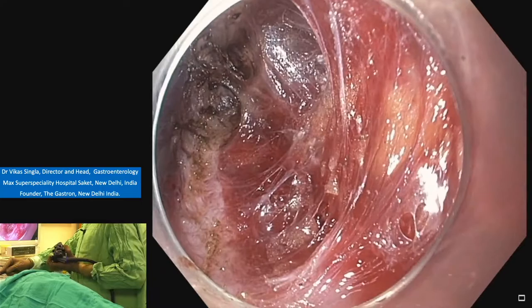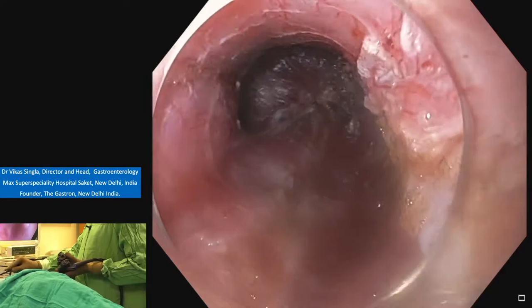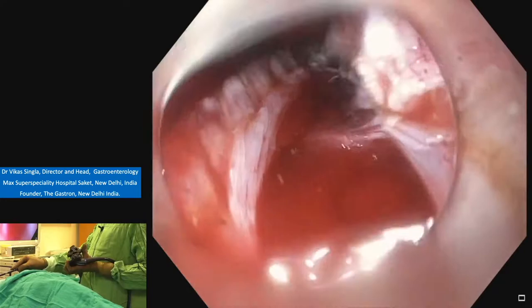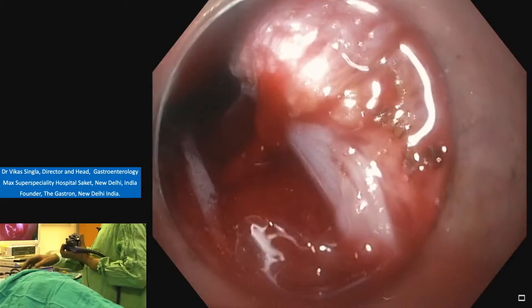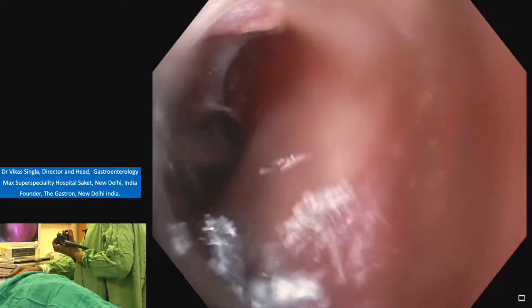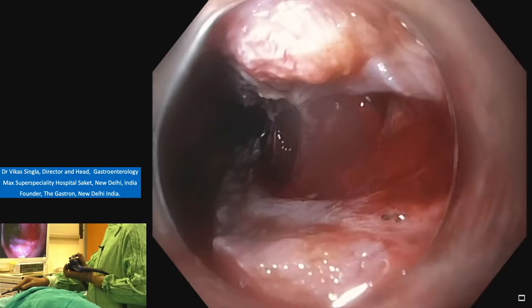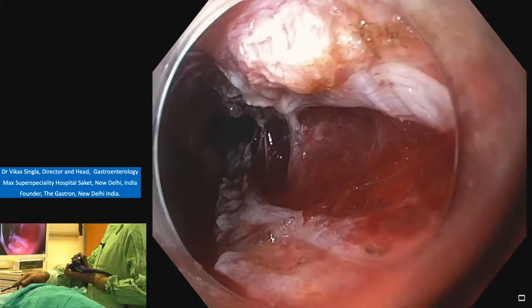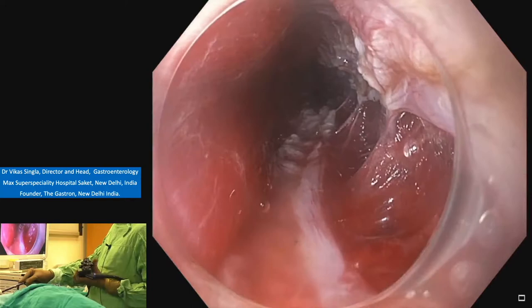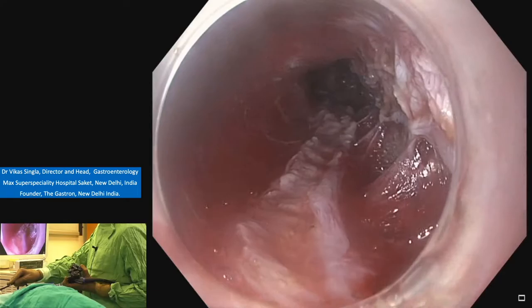On the right side we can see it's perigastric fat, which means we are onto the gastric side. Some blood there, maybe the old floppy blood, or you have to see this area. Seeing some old blood without any active ooze. So it's around 5 cm myotomy on the esophageal side and 2 cm on the gastric side.